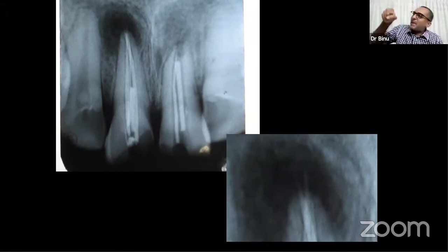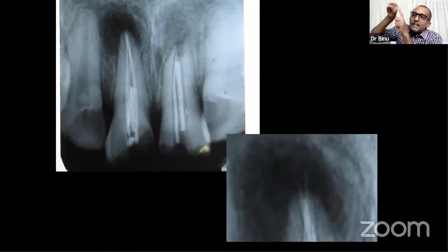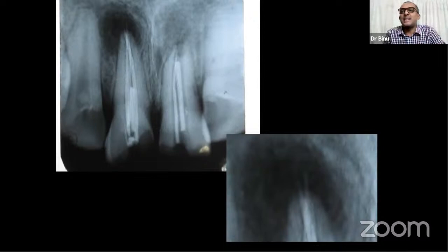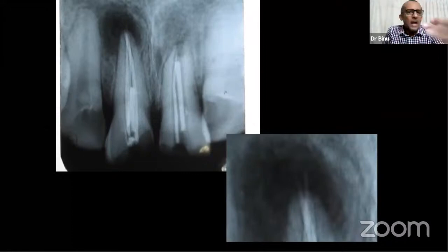Never show the patient with that forceps like this. Another 30, 40 seconds I spent, put that film in the view box. The chair has a view box. Put the film there, take a picture, crop it, bring it to the computer, show them in style. Before I even had RVG. So now with the RVG, things have changed completely. So I don't think these slides are relevant anymore.